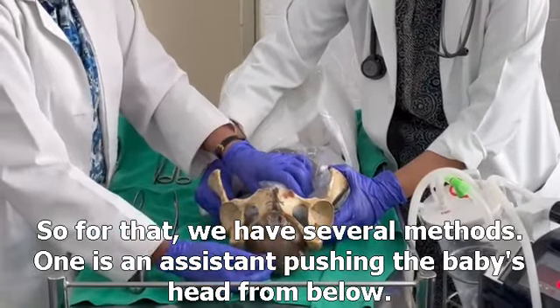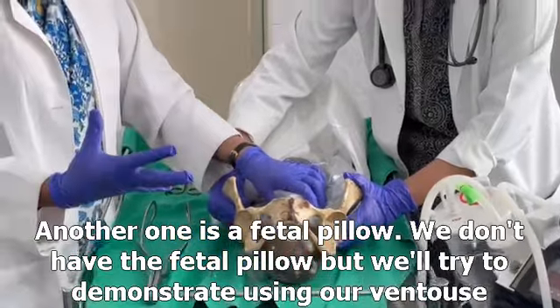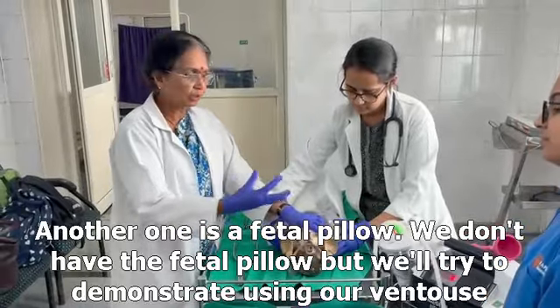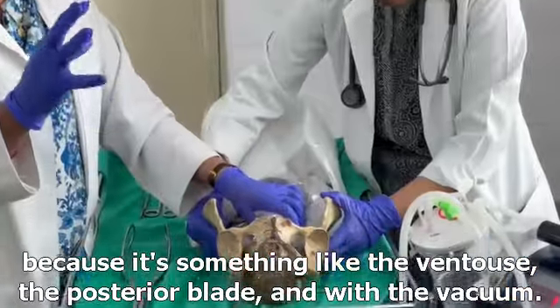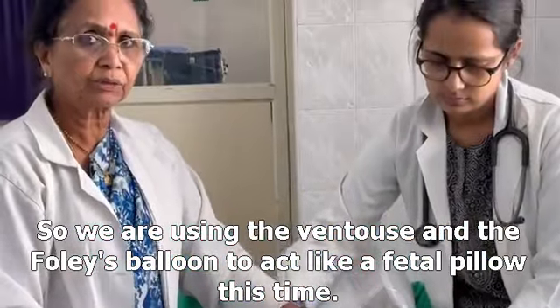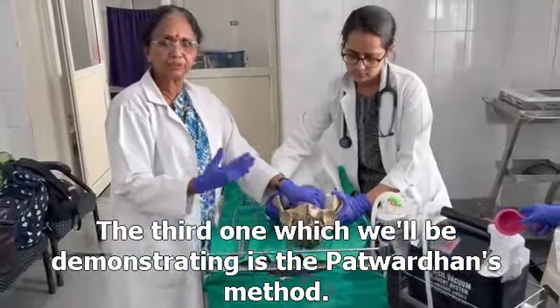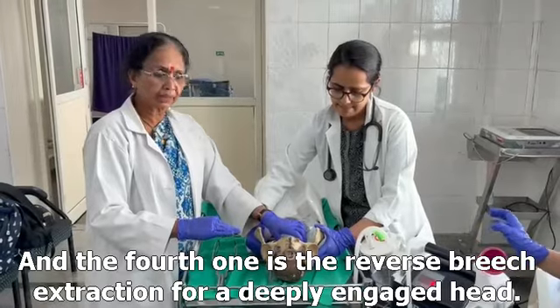One is an assistant pushing the baby's head from below. Another one is a fetal pillow. We don't have the fetal pillow, but we will try to demonstrate using our ventouse, because it's something like the ventouse with a posterior blade and with a vacuum. So we are using the ventouse and the Foley's balloon to act like a fetal pillow this time. The third one which we will be demonstrating is the Patwardhan's method, and the fourth one is the reverse breech method for deeply engaged head.